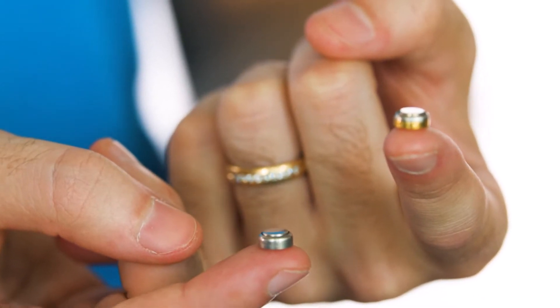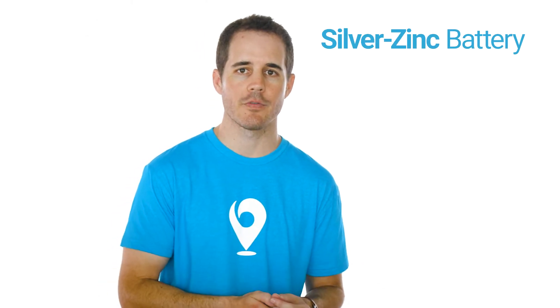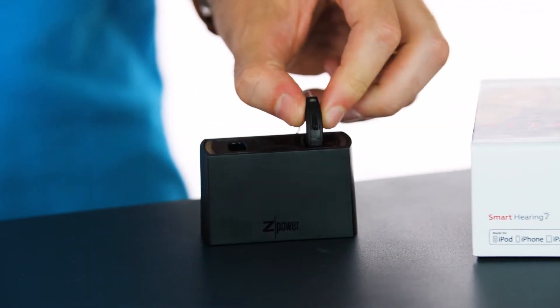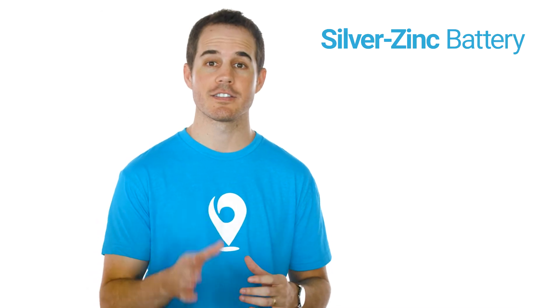The difference is that the silver zinc rechargeable battery can be used over and over again — you just charge it when you're not using it. It'll fully recharge in three to four hours and provide power for a full day. When you're not wearing the hearing aid, you just set it in the little charging stand, wait for the green lights to start flashing, and a few hours later you'll see a solid green light, which means you're fully charged up.